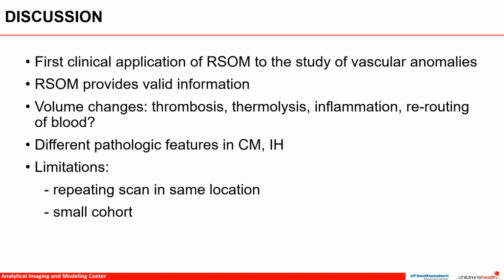Our study had limitations. First, it's difficult to scan the lesion in the exact same location every time, especially when having to do scans at different points in time or by different users. We took several precautions for this, such as documenting our scan location, scan head orientation, measuring the exact location, and having the scans be done by the same user.